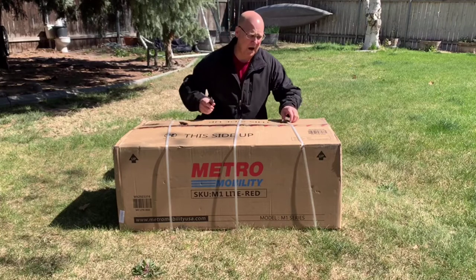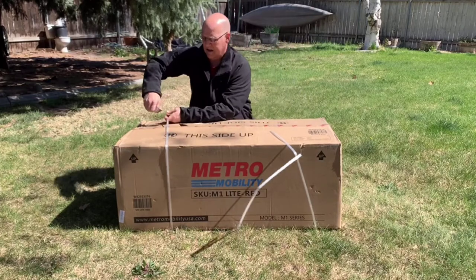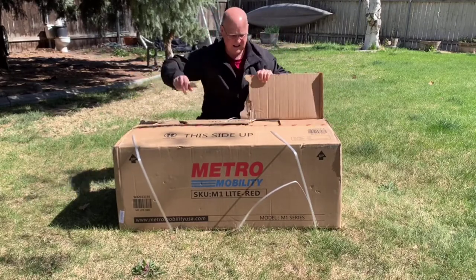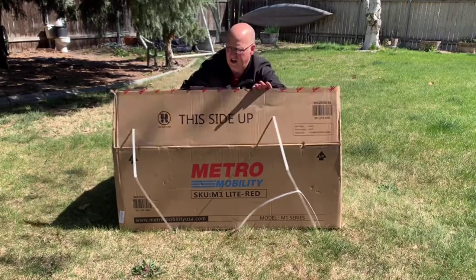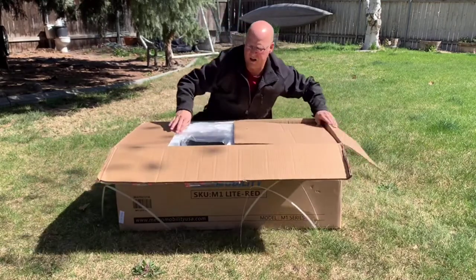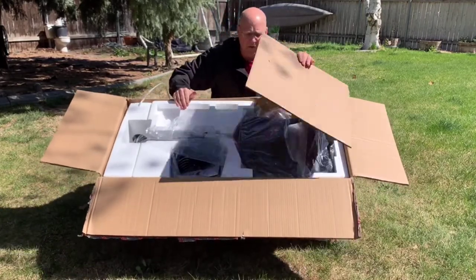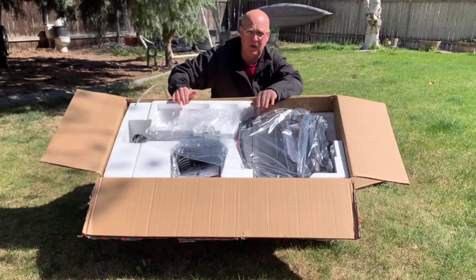Got this mobility scooter for my mom. I wanted to show you what it looked like whenever we unpackaged it. So once you get it open, it's well sealed in this foam. I'll get it out of the packaging, and we'll read the instructions and get it set up.